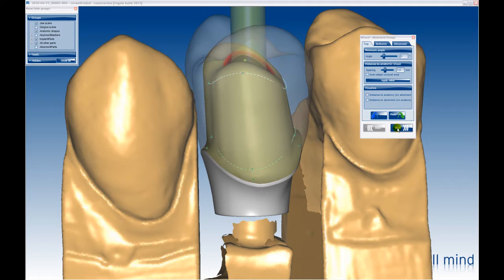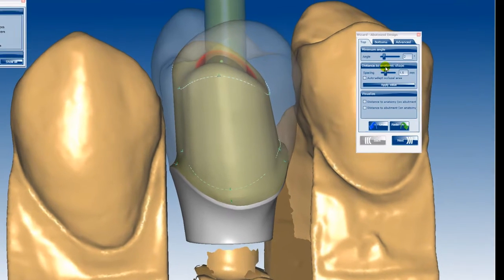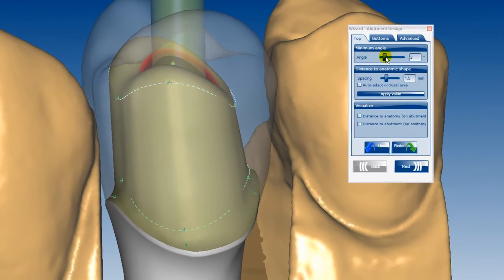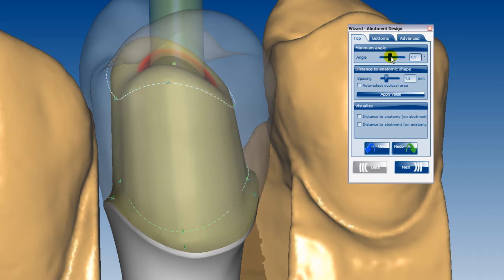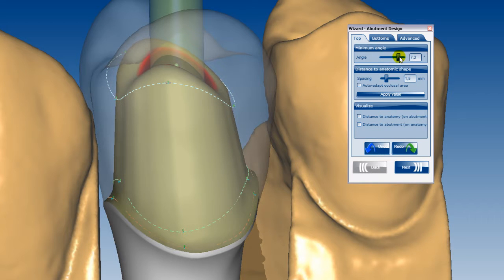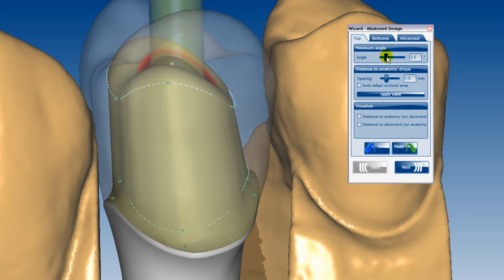The software automatically generates the basic shape of the upper section of the abutment. It is possible to change the angle of the abutment sides. Further adaptations can be set using the value of the distance to the anatomic shape.